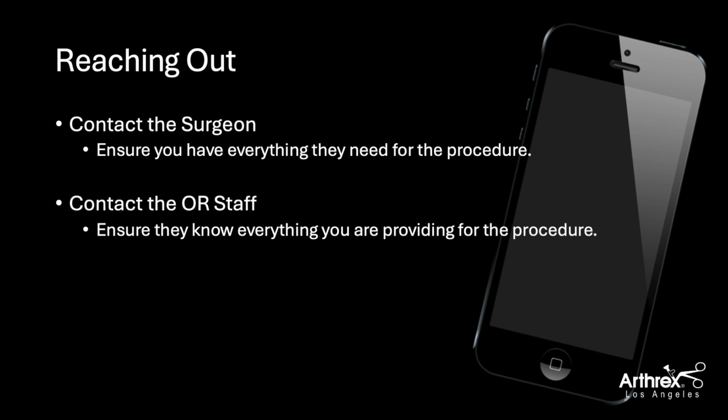Once you identify that you have a case, we want to make sure that we have the hospital or location in mind. Once you get that, we're going to call the hospital and get the current setup on the time, what level they're going to be doing, as well as what instruments are needed. Once we ascertain exactly what kind of case it's going to be, we want to make sure that we contact the rep or the physician if you have any questions regarding what they need as far as instrumentation, disposables, and what the parameters are of when we need to get the equipment to the facility.